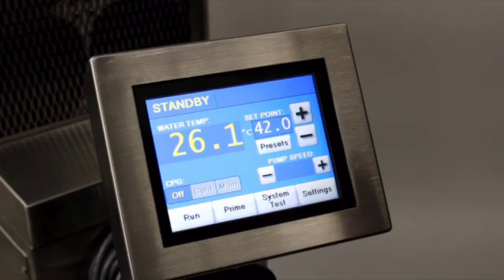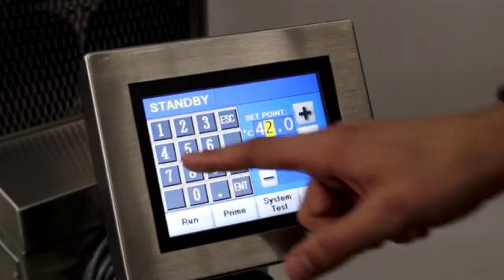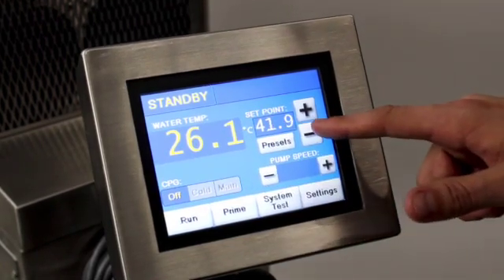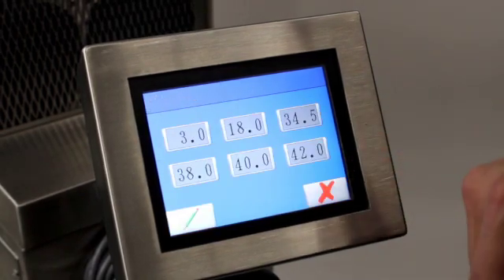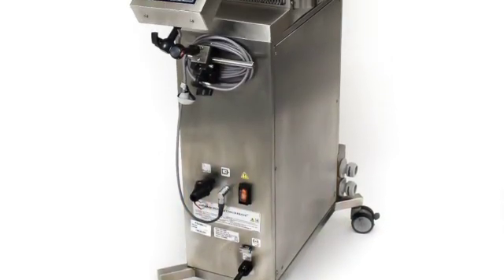Here, you can set the temperature three ways: press the Set Point display to manually input the water temperature, the plus or minus buttons to adjust by 0.1 degrees Celsius, or press the Presets button to set the temperature to a preset value.